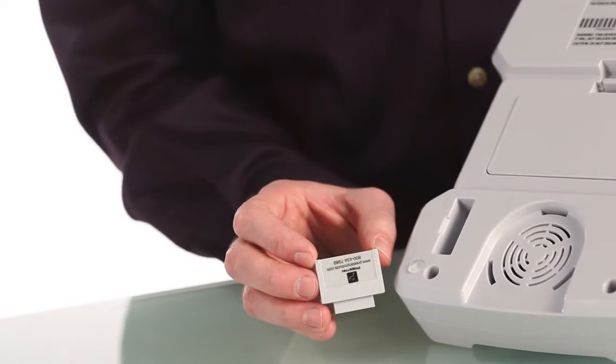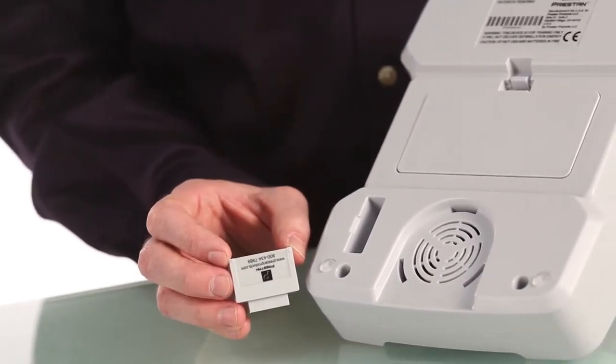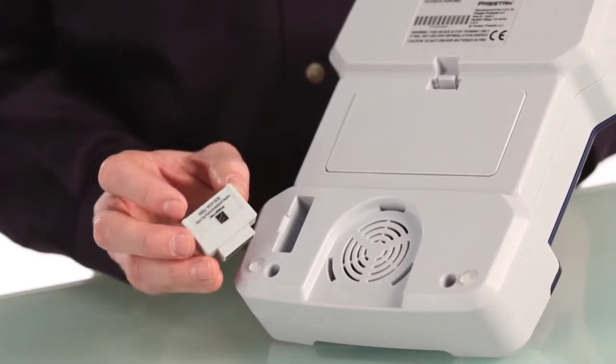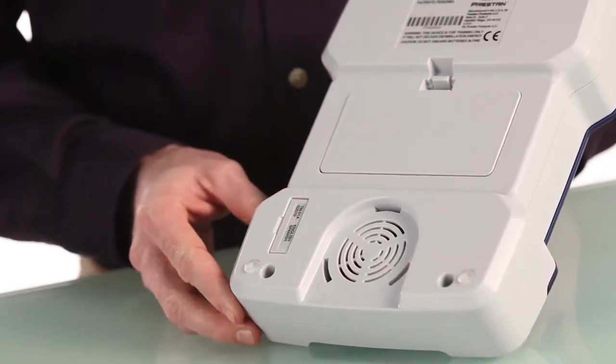The module will always contain two languages. In this case the two languages are English and Spanish. This is the area where you insert the language guidelines module. The module can only be inserted one way due to the unique design of the slot.